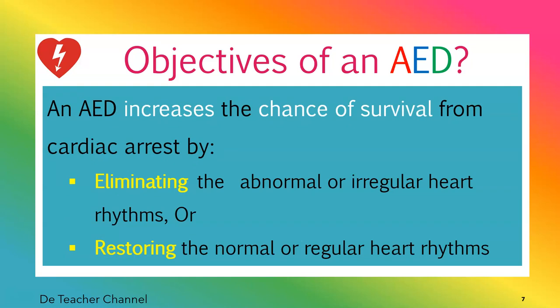So, objective of an AED, what are the objectives? An AED increases the chance of survival from cardiac arrest. That is one of the reasons why you bring an AED to a cardiac arrest scene. It can even double or triple the chance of survival. How is that done?